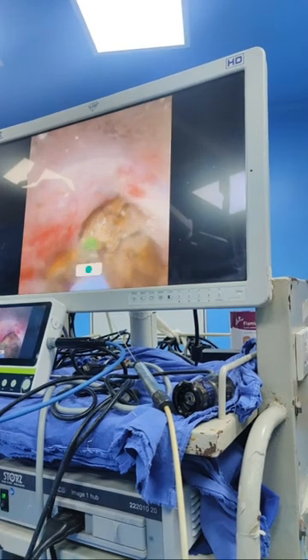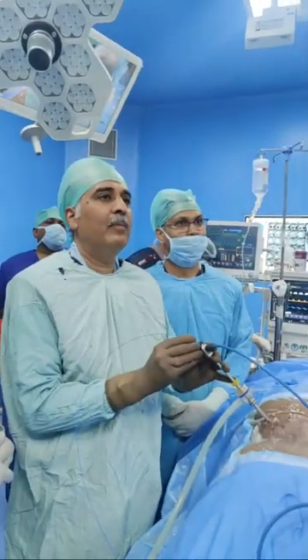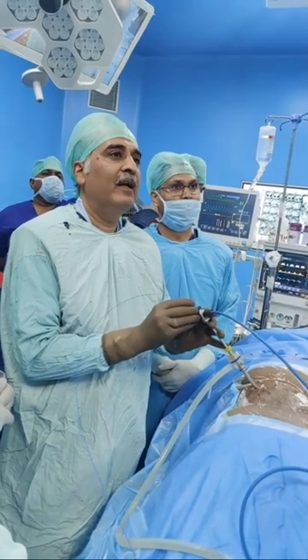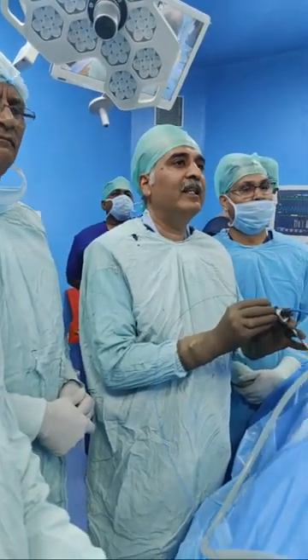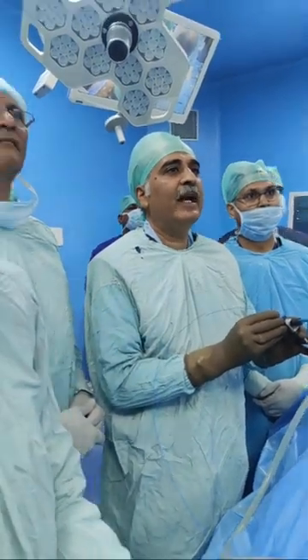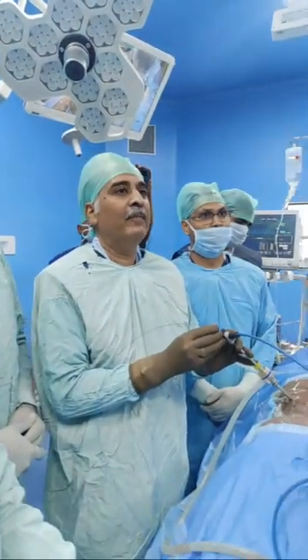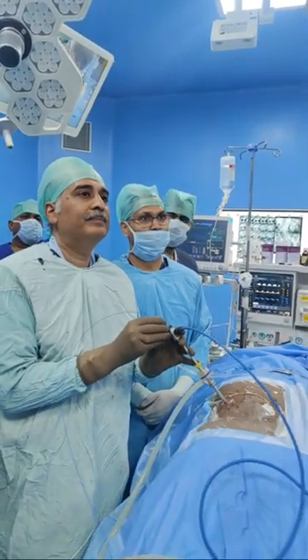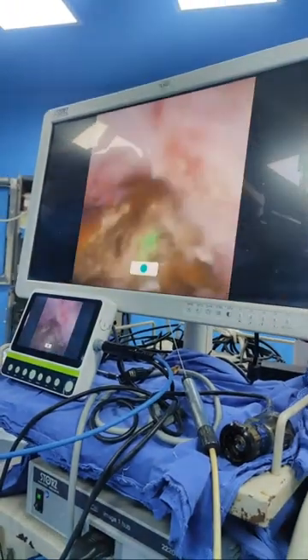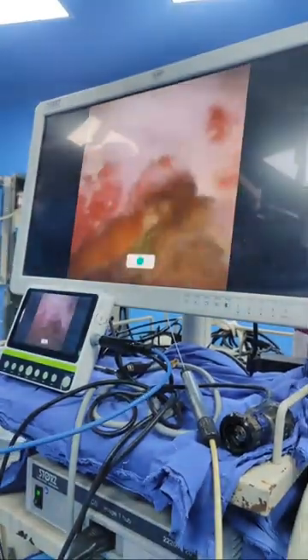We are trying to just maybe pulverize the stone also, and those very, very small pulverized fragments would just be sucked in automatically, and those small fragments have to be just pulled out by suction. So this is how the whole staghorn stone is being done without using the forceps at all. Why we are using a big nephroscope is so that we can take out a very big fragment. Here that need does not arise, and therefore even the small scope can do well.